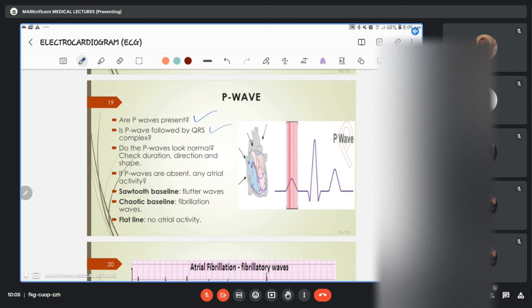waves that are negative. Now you should know, because each time I label them, here we have Q and S are always negative. This is the positive side. If you find P, which is supposed to be positive, being negative, then there's an issue with the P wave. And the definition of P wave is what? Atrial depolarization. That means your concentration should be towards just the atrium of the heart. That's how these things help you to get ideas about diagnosis.